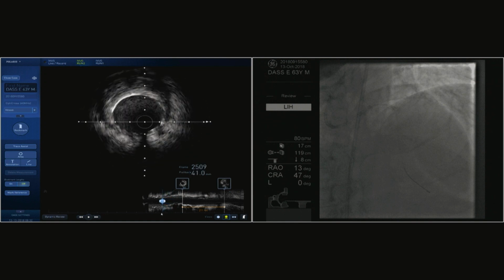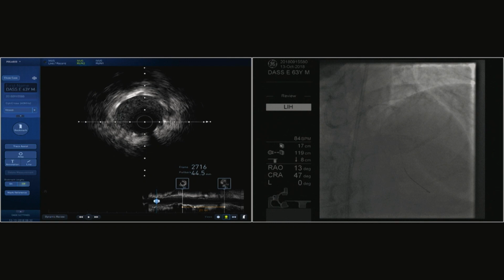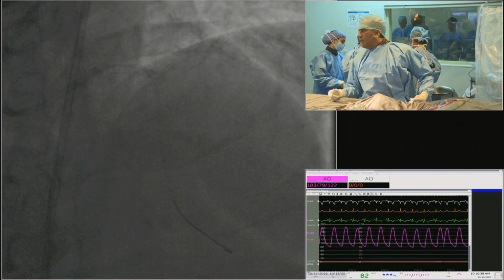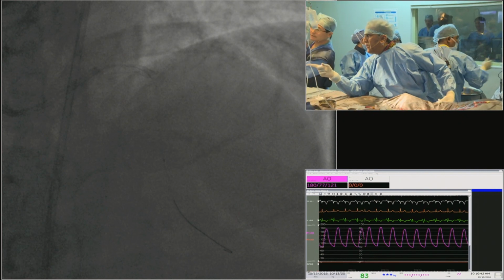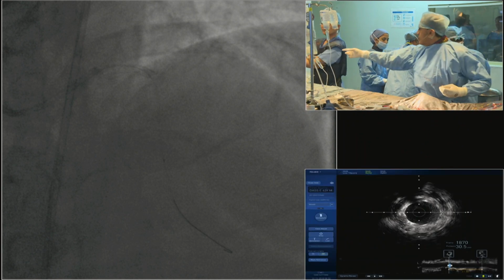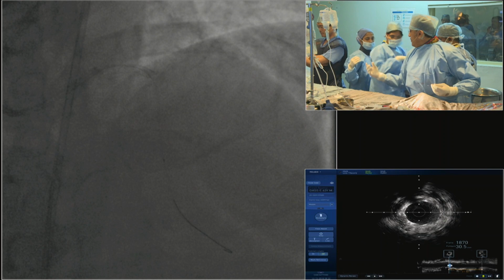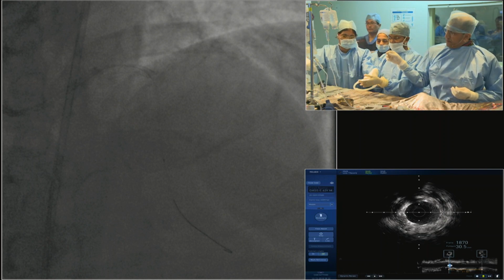But Dr. Seth, would you like to say? Would the radial strength matter? Right. More than the radial strength, the longitudinal foreshortening is very important in left mains. Give me the length of the second stent that I require from the 2 bookmarks. What is the length that you calculated? 22? I think 22, 23. Yeah. At the end of the day, it does provide for bulky plaque, calcification and other unfavorable features. Give me a 4.0 short balloon.